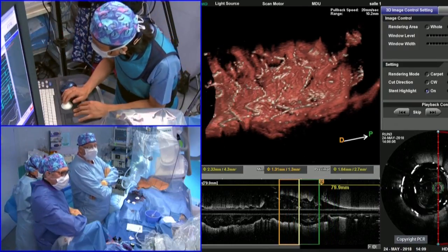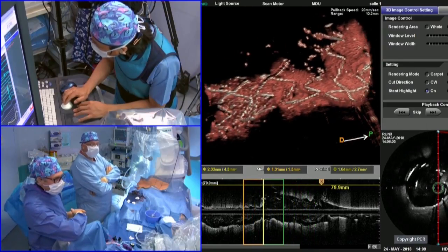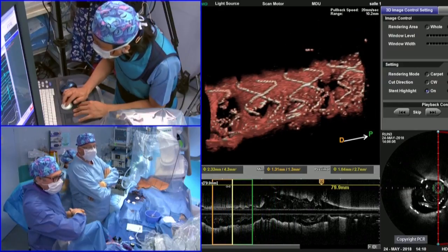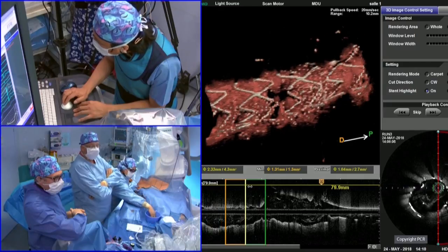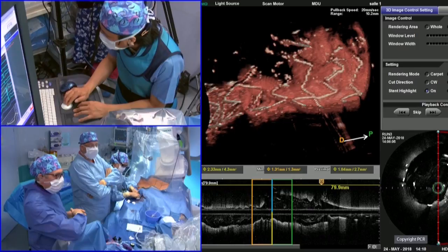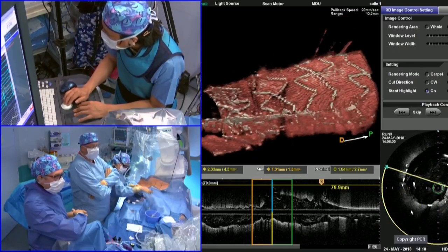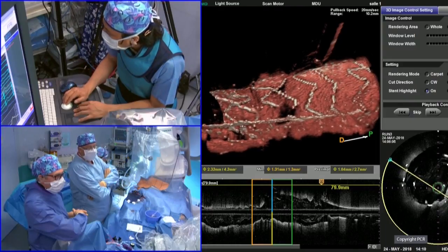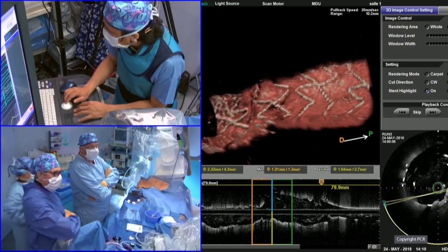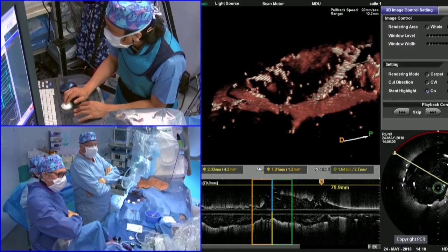And to continue with the question on POT to decide whether to do kiss or not, POT is actually just opening the stent struts widely in front of the side branch. It does not determine whether you should do it or not. It just enhances recrossing. Kissing has two purposes. One is to remove struts from the ostium and re-establish better flow, and on the other side, simultaneous inflation of two balloons puts the carina in the center. So you actually reconstruct the natural geometry of the bifurcation.